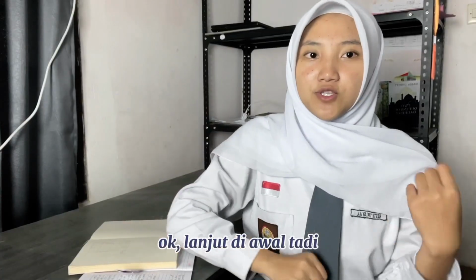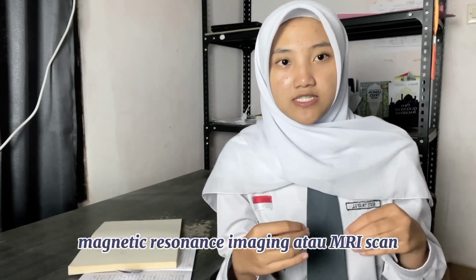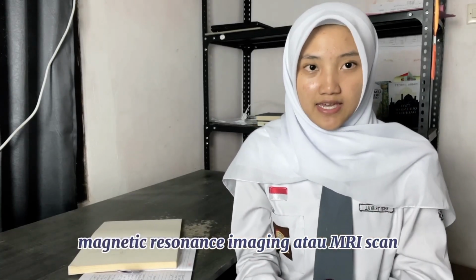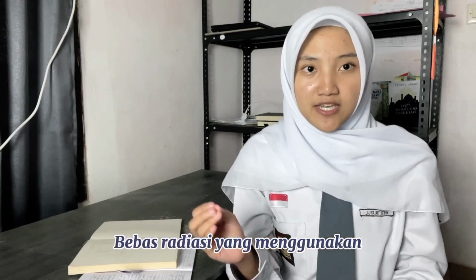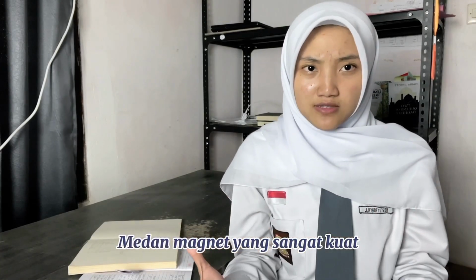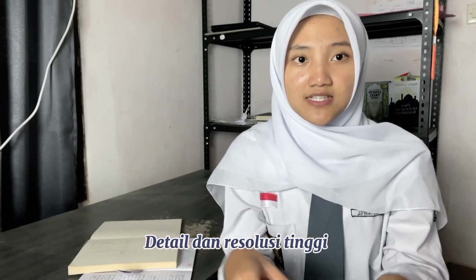Okay, let's go back to the beginning. The definition of magnetic resonance imaging or MRI scan is a non-invasive, radiation-free medical imaging technique that uses strong magnetic fields and radio waves to produce detailed, high-resolution 3D images of organs and soft tissues.